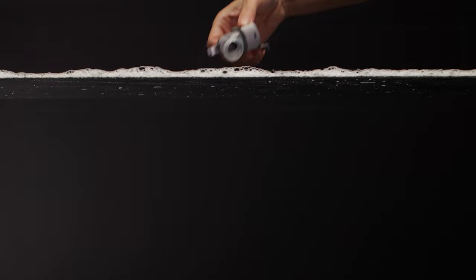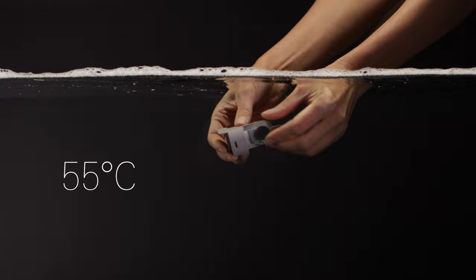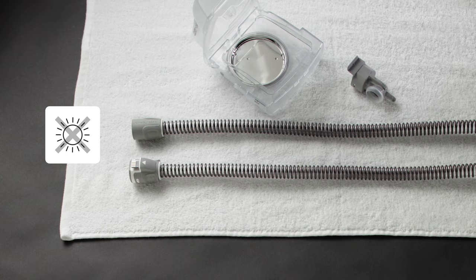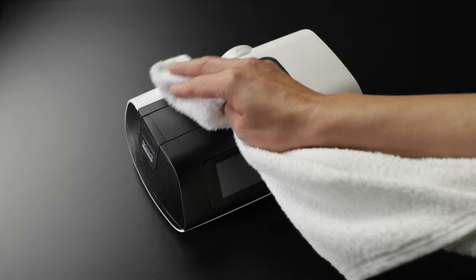Weekly cleaning. Wash the humidifier tub, air tubing, and outlet connector in warm water using a household dishwashing liquid. Components should not be washed in temperatures higher than 131 degrees Fahrenheit or 55 degrees Celsius. Rinse each component thoroughly in water. Allow to dry out of direct sunlight or heat. Wipe the exterior of the device with a dry cloth.